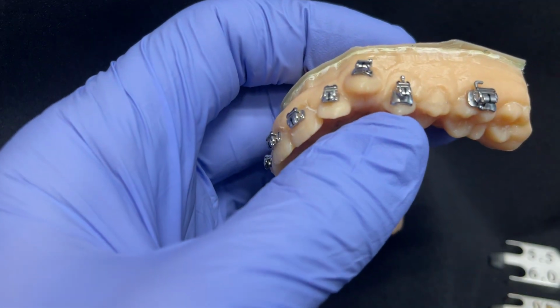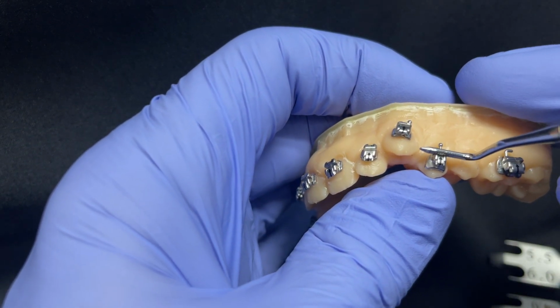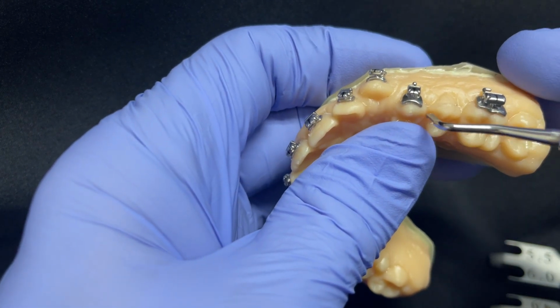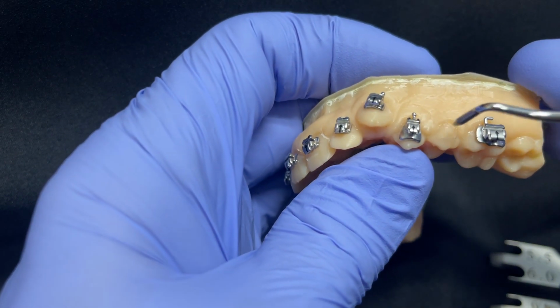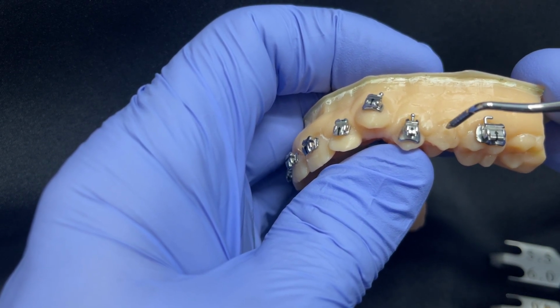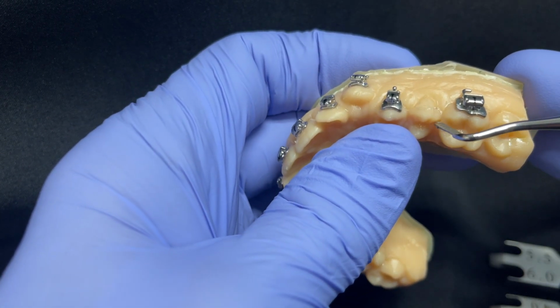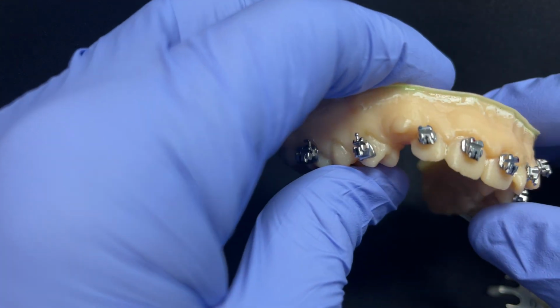All right, so once again, we do have a little bit of a mesial inclination on this 4 here. So I'm just going to put that there, and we're just going to basically put this 5 on, and you can see there's a marginal ridge discrepancy here and here. So when this bracket goes on, that slot needs to be about 0.5 millimeter gingival, so that we can extrude it into a good occlusal relationship. Okay, when it's all said and done, we have a marginal ridge, it's all matched up. All right, so that's how we would set up this little case here.